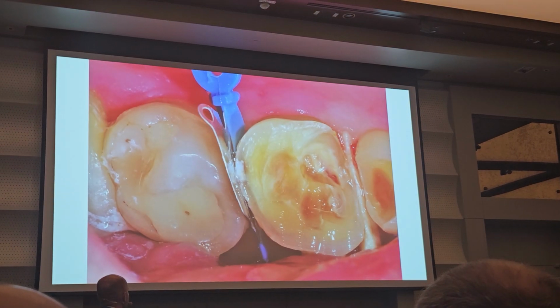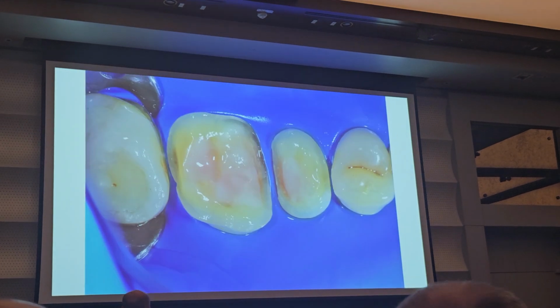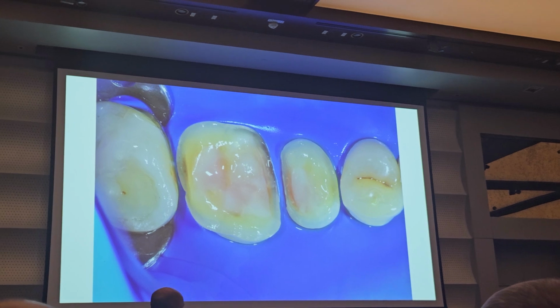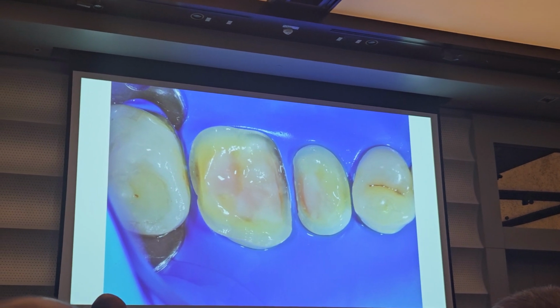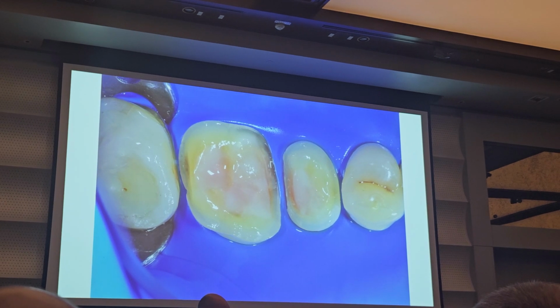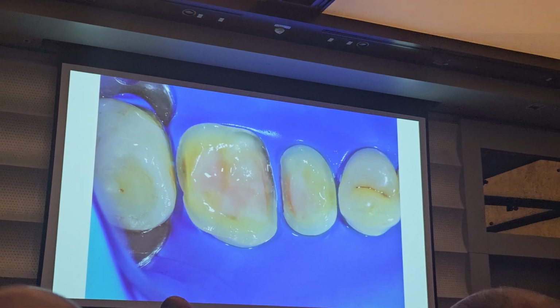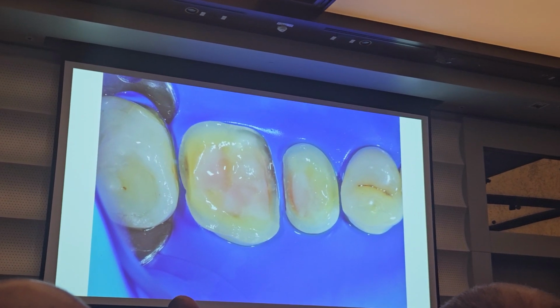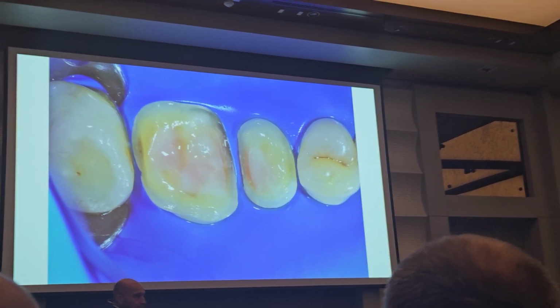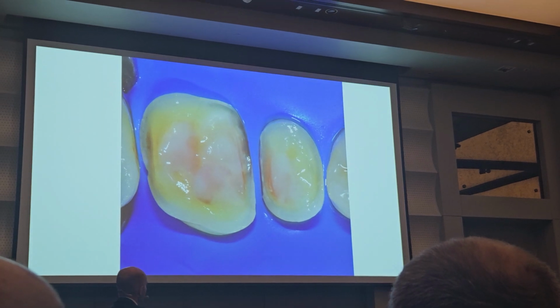Okay, let's test. I do the immediate dentin sealing, then I prep the enamel, all the stuff, no resistance. And that's the first problem. The technician doesn't know how to keep this onlay stable, even when he does the workshop. And the problem, I have not the right position, I have not an index. So it's a circus. I cannot test the contact area in the mouth of the patients, because my assistants put the finger, but it slips. Anyway, we put them in the mouth of the patients after 2 hours of work.